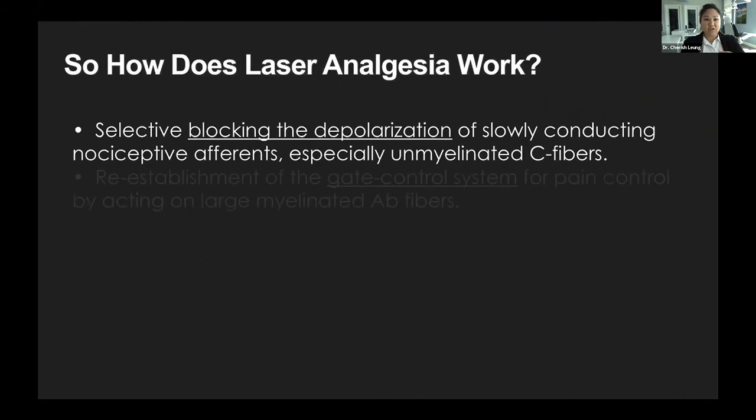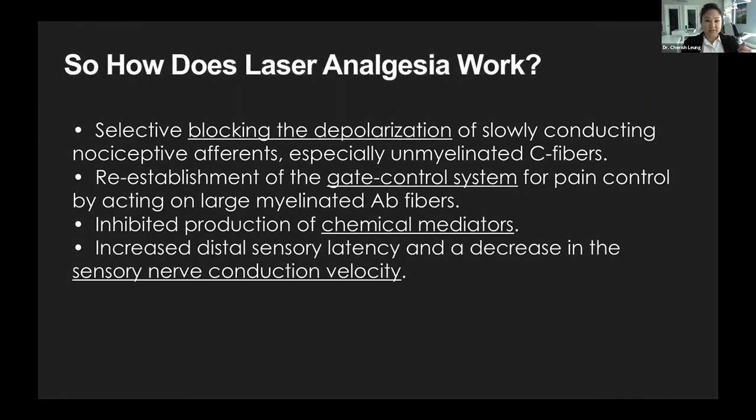So how does the laser analgesia work? This is the scientific part, but basically it works similar to when you're jiggling the cheek while giving local anesthesia, by disrupting the pain signals. And so you get some laser analgesia, and it lasts a little bit longer.